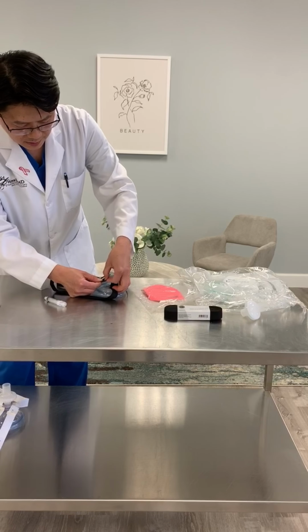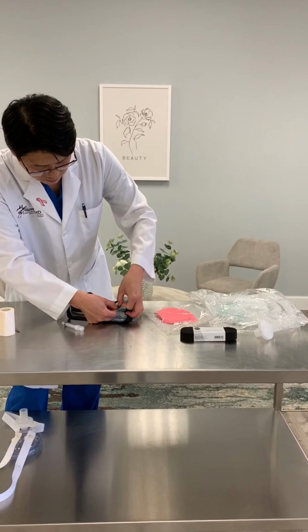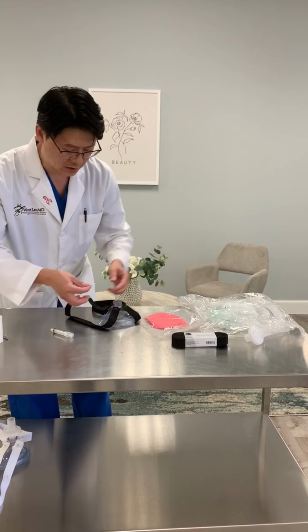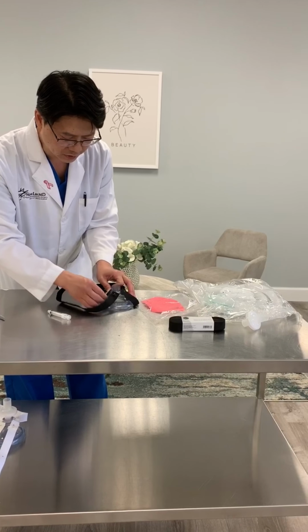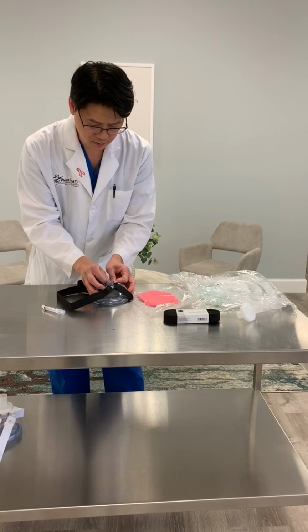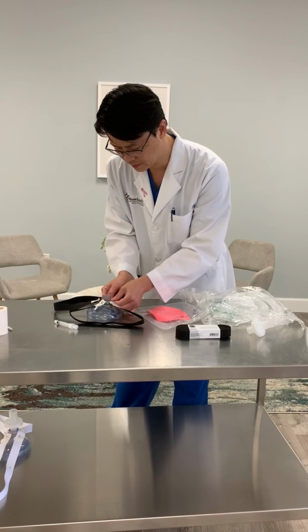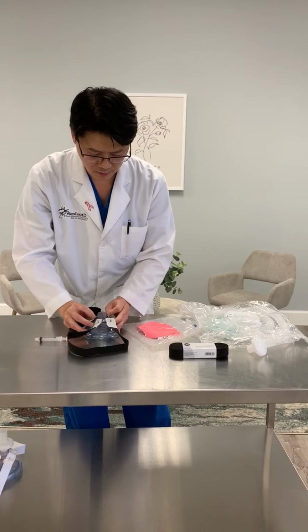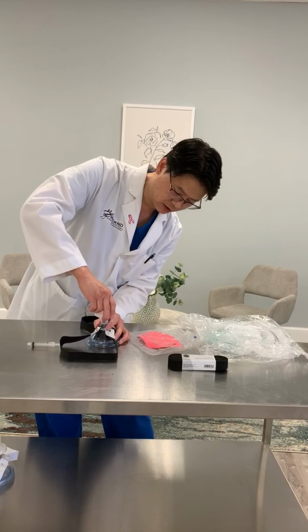For added security so that this doesn't easily pop off, we're going to use the silk tape. So peel the silk tape, take a rectangular piece, and in a similar fashion without cutting it, just gently push, and this adhesive will help to secure it in place. Okay, so the longer end is on top, the shorter end is around the bottom. And then you take your antiviral filter. There's only one way that it can fit, and you just wedge this on.